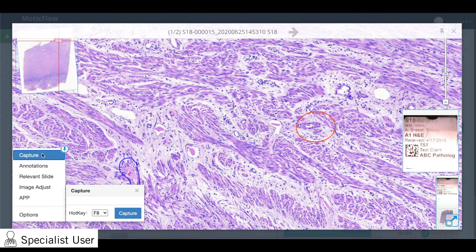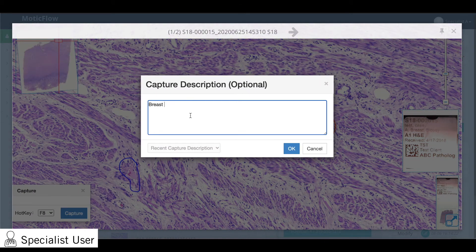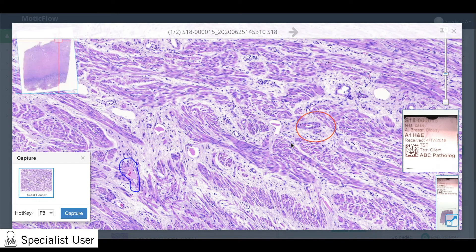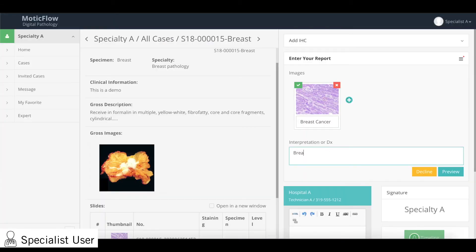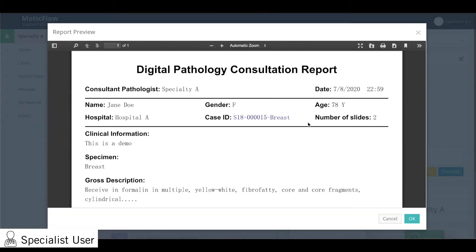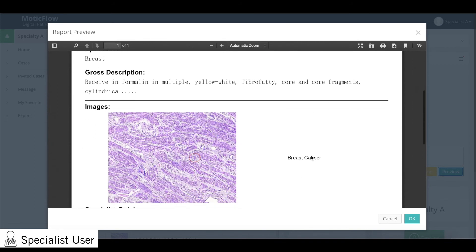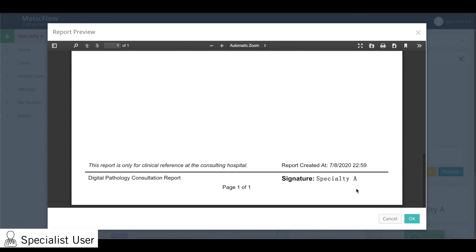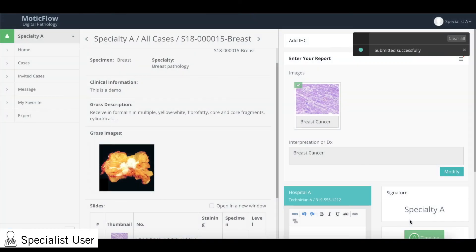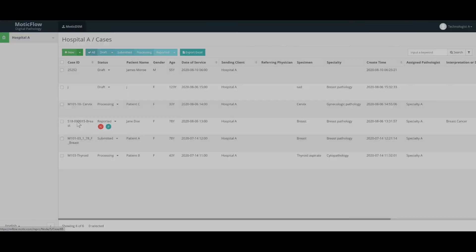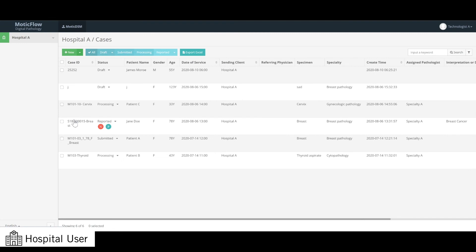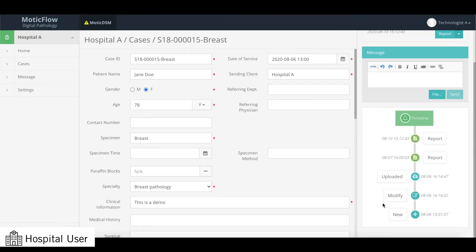Finally, to provide the final report, capture at least one area of interest and add your interpretation before creating the final report. Once the report has been submitted, the hospital user will receive an email notification and can go back in to see the tracked case history, the diagnostic report, as well as any past report versions.